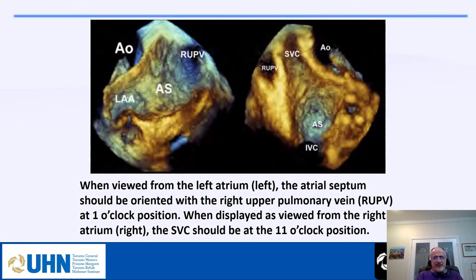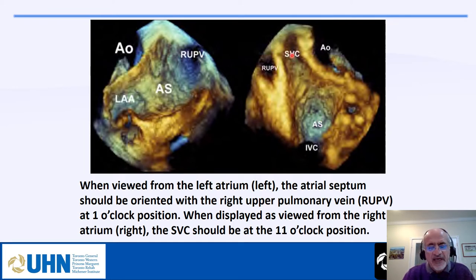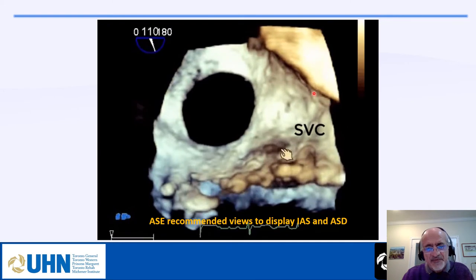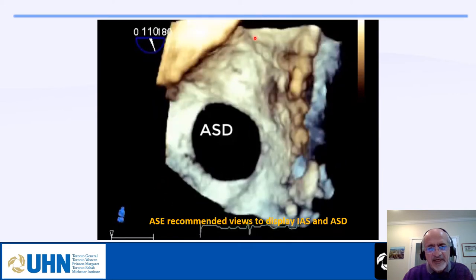This shows displaying the interatrial septum based on the American Society of Echo recommendations: when shown from the right side, the SVC should be at 11 o'clock; when shown from the left side, the right upper pulmonary vein should be at 1 o'clock. This animation demonstrates the display — this patient has a large secundum ASD. From the right side, here is the SVC going to about 11 o'clock.